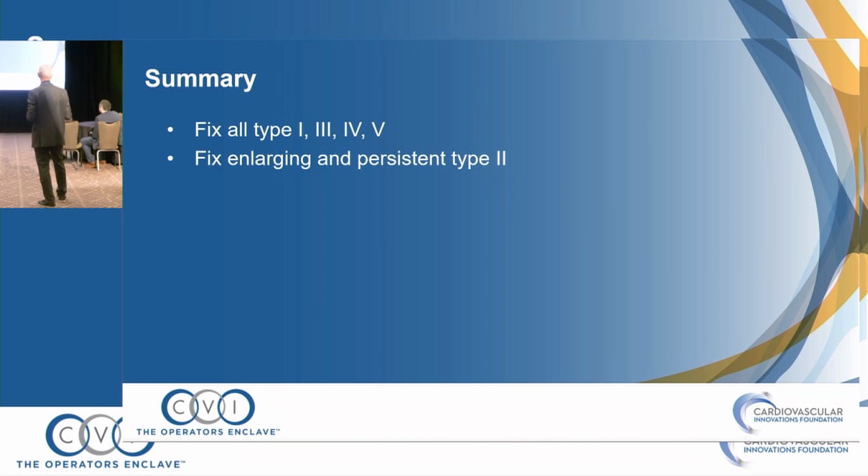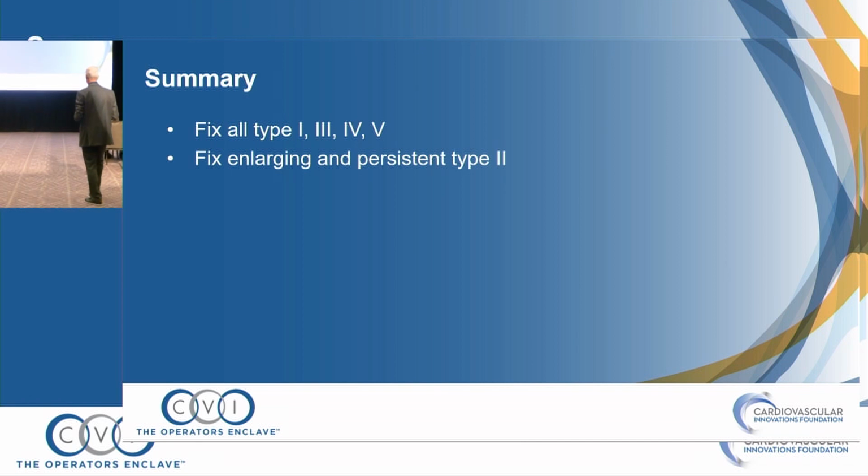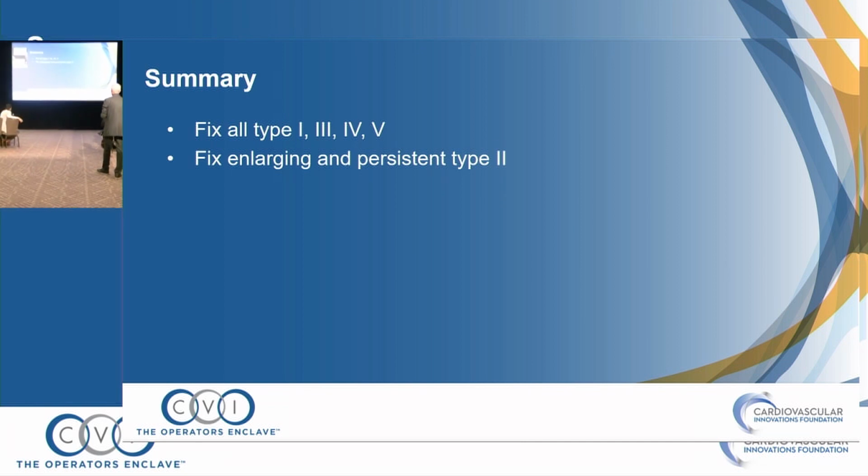I have a question for you, John. Let's say you see someone who had a 5-centimeter aneurysm fixed, which we see every now and then. Are you going to wait on an endoleak to make that aneurysm get to 5.5 or greater before you treat it? Or are you going to say any growth, even if it's below 5.5? Oh, I see. So you fixed a 4, and it's gone up to 5, and you still haven't even hit the threshold for the risk of rupture, 5.5, which is still below the threshold to fix it.